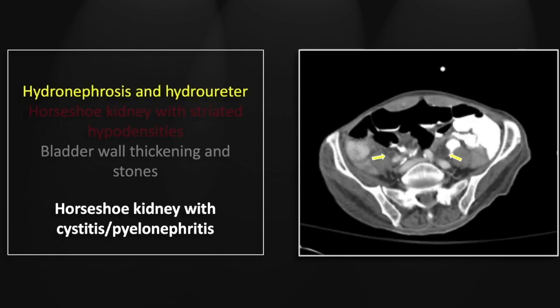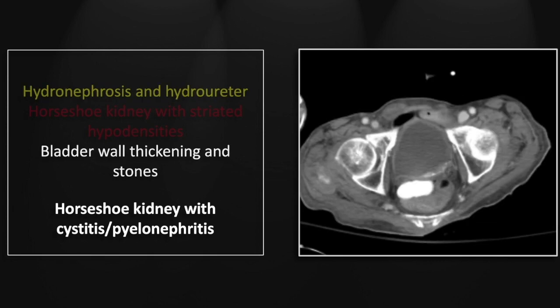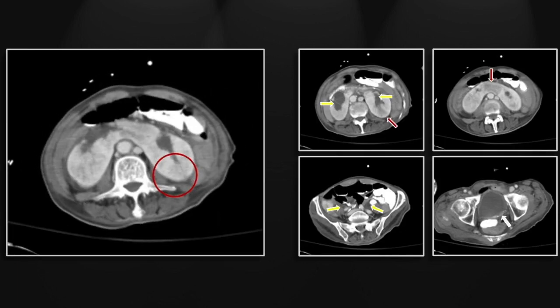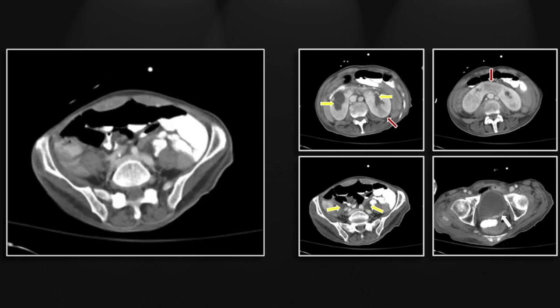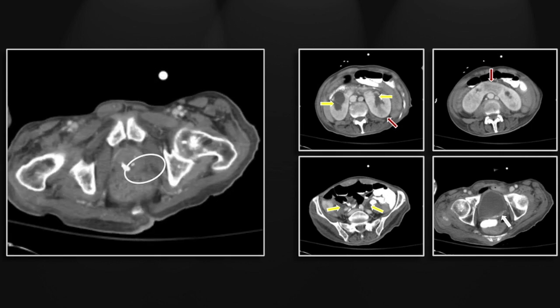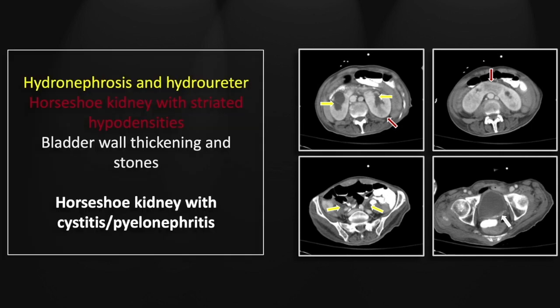In the pelvis we have bilateral hydroureter and the bladder demonstrates irregular wall thickening as well as layering tiny gravel-like stones. Of course with horseshoe kidney, patients are at risk for increased stone formation as well as pyelonephritis. There the pyelonephritis and in the bladder gravelly dependent stones. So that is a case of a horseshoe kidney with cystitis and multifocal pyelonephritis.